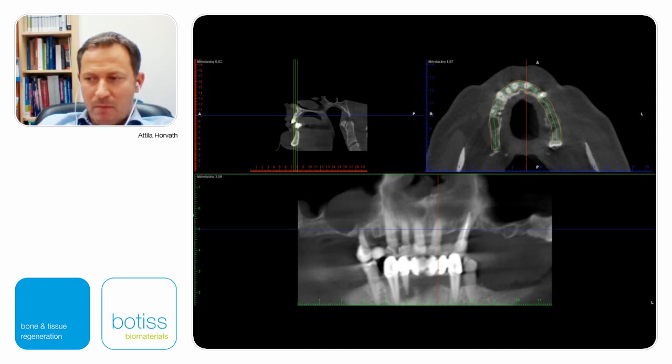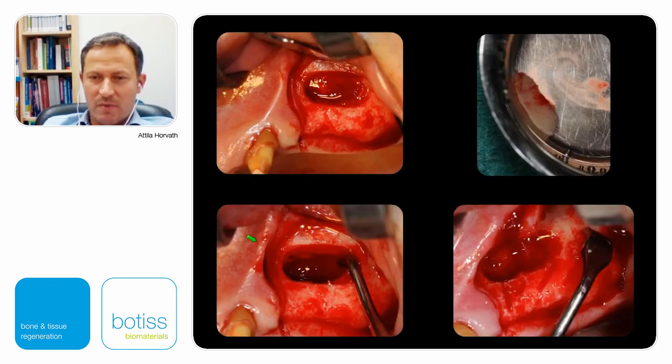Now, before we go to the 10 minutes question, I would like to show a case in order to go back a little bit, relax, and just see not pure treatment guidelines, but have a look at the clinical situation. This is a clinical situation in perio patients. Of course, we do perio first, but once the perio is stable, then this patient is ready for tooth replacement with implants. Certainly, we do need to do some GBR procedure, as in this picture.